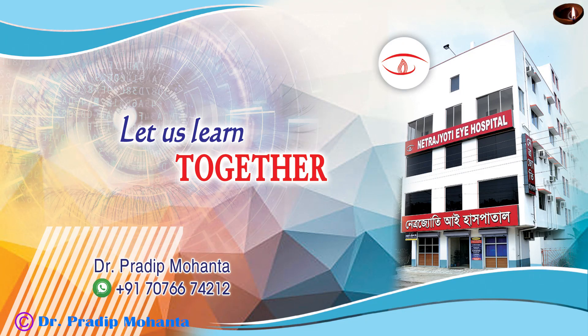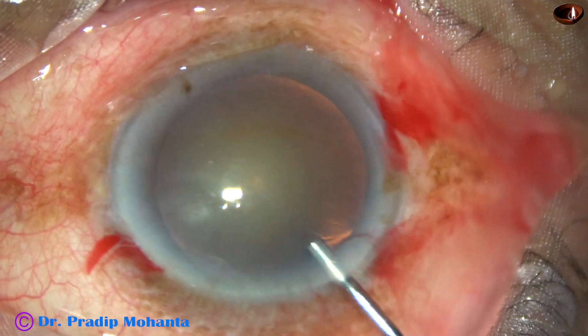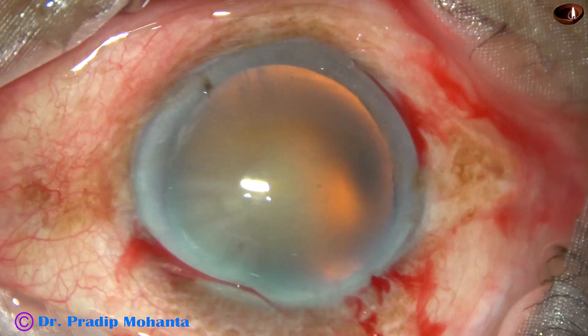Friends, this is phacoemulsification of a cataract with grade 3 nuclear sclerosis. After making the incisions, 2% HPMC is injected into the anterior chamber and it is applied over the corneal epithelium for better visibility.